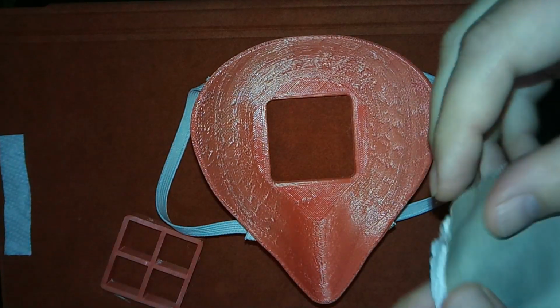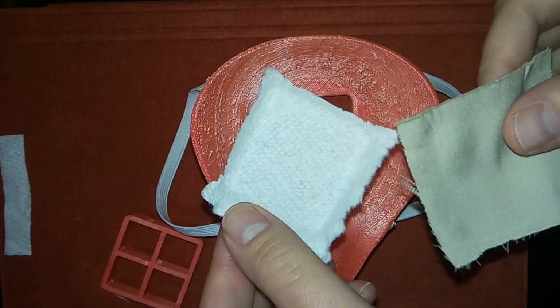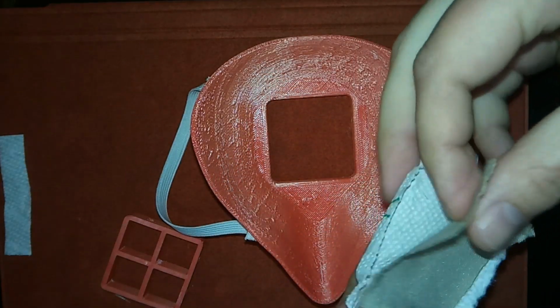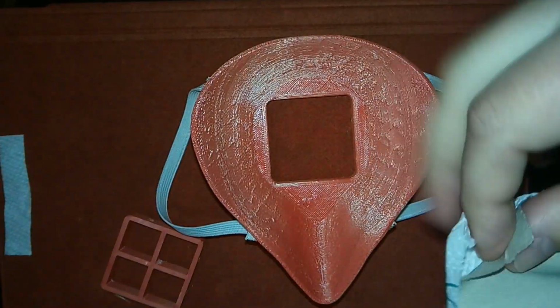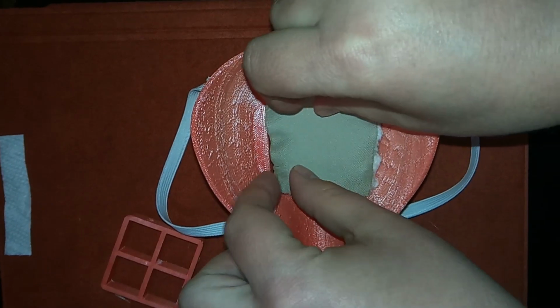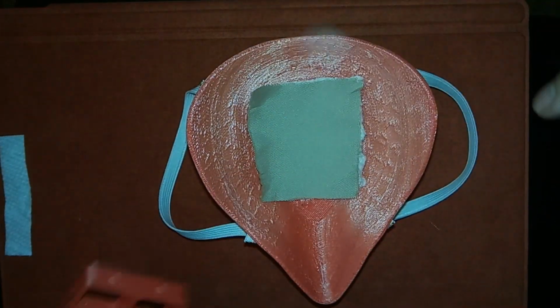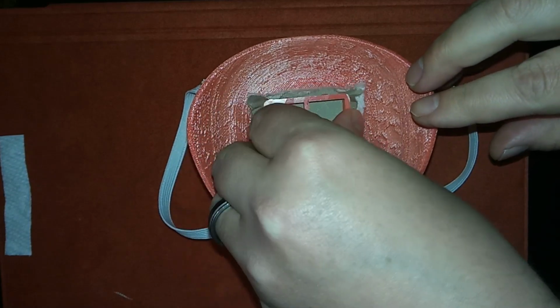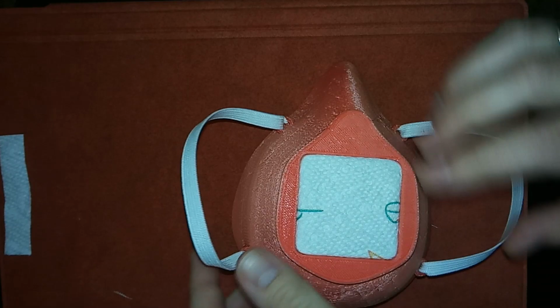Here I'm showing you how to assemble the filter. Now, normally you'd use a surgical mask filter or an N95 filter material, but if you don't have that at home, some literature I've read says that you can use some fabric, and then I'm also supplementing that with a piece of paper towel, so you can use it as a filter mask.